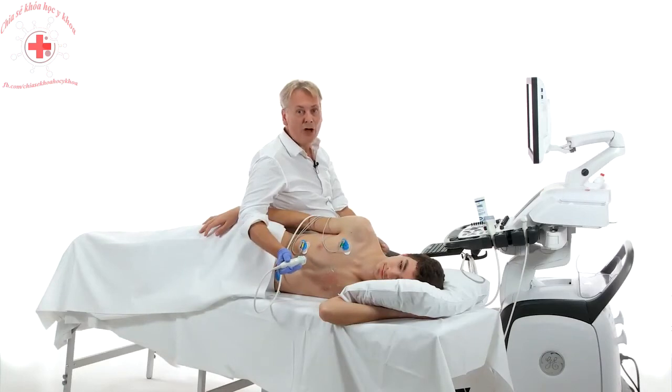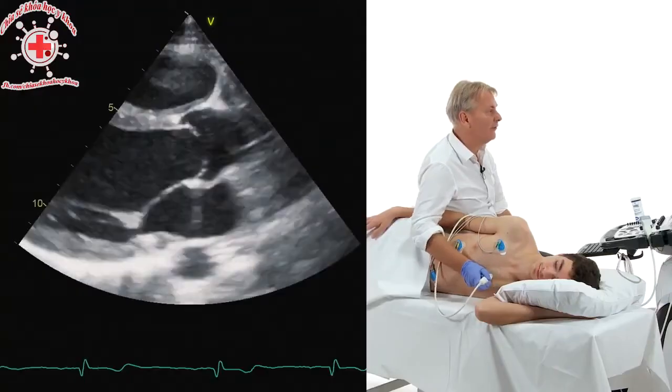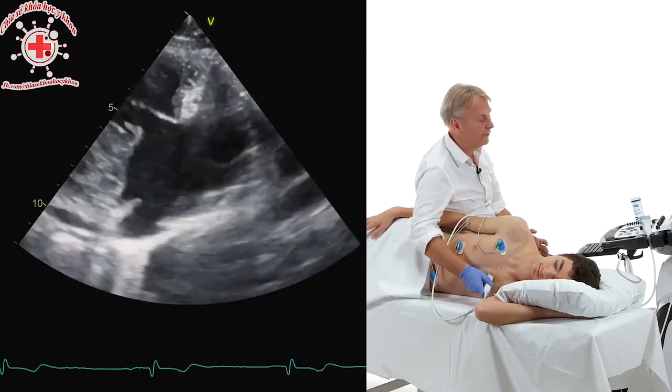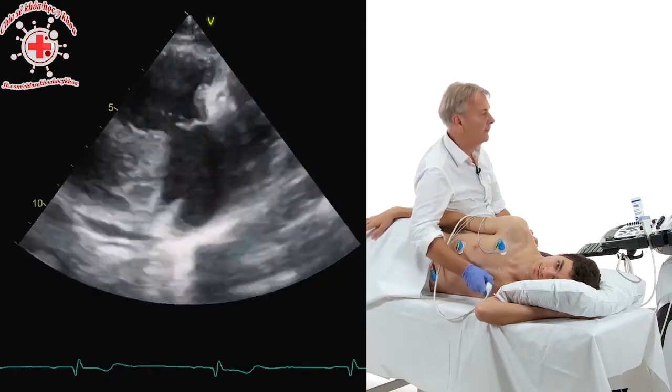The parasternal long axis view through the right ventricle is such an important view, and actually I think that it should be a part of every exam. And it's very easy to get. You start out from a parasternal long axis view, and all you need to do is tilt the transducer down. This is the motion you perform to get the long axis view.